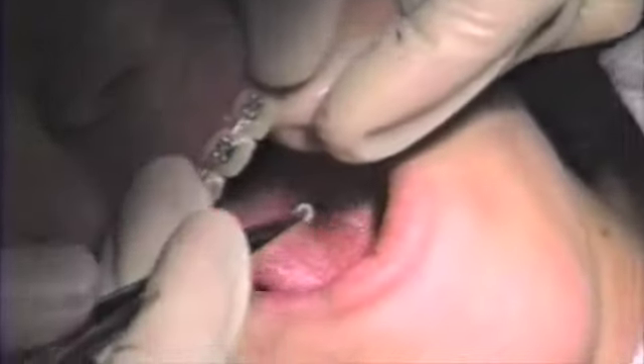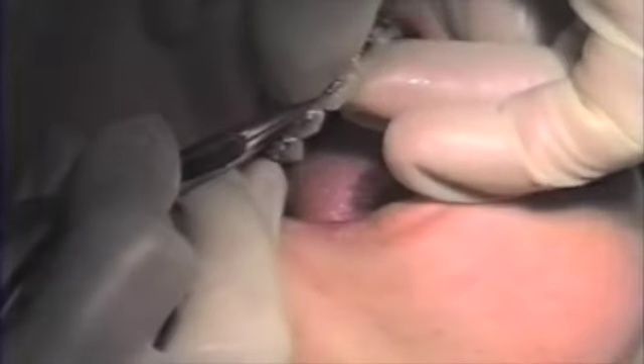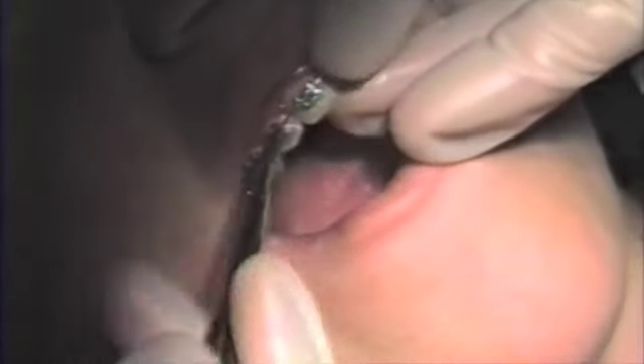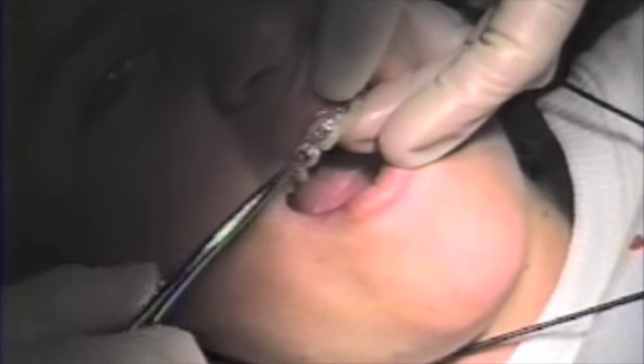The only problem with the figure eight elastic tie is that oftentimes you will slip during the placement, or the elastic will break, many times causing discomfort to the patient.